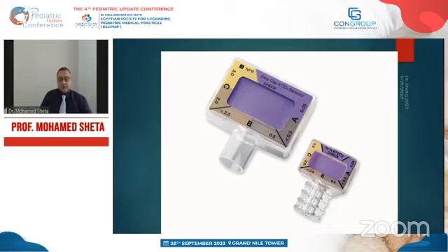So after you insert the catheter inside the trachea in the larynx, you can connect the CO2 detector through the tab of the ET tube. If the violet color changes to yellow color, it means it's inside. At this time, you can remove the CO2 detector and give surfactant because you confirmed the position.